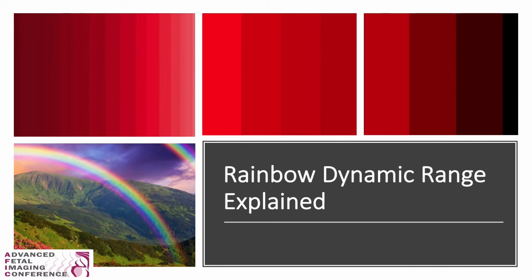Okay. Red contains different shades such as cherry, rose, crimson, ruby, mahogany, scarlet, cranberry, maroon, burgundy, to name a few. It's almost an endless amount just within that color. So let's look at the top left image. We can see as we move from left to right, the shades go from darker to lighter, but it's difficult to see exactly where certain shades end or begin. The image appears smooth or blendy.